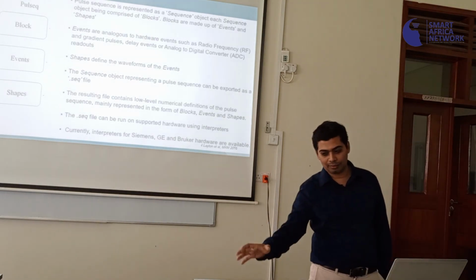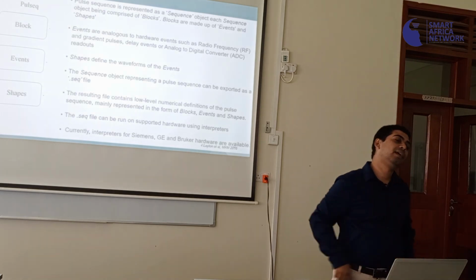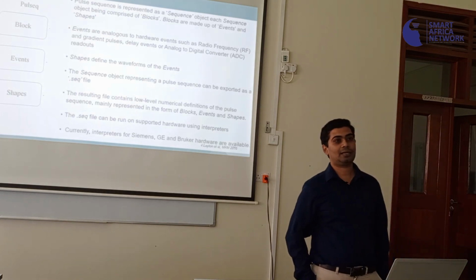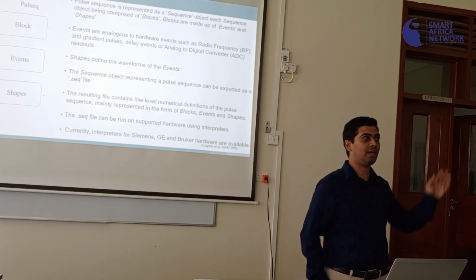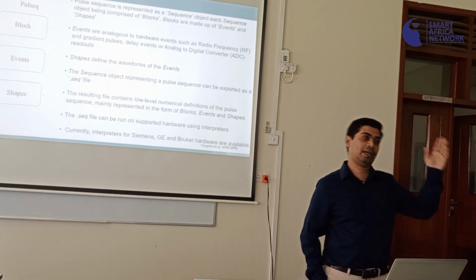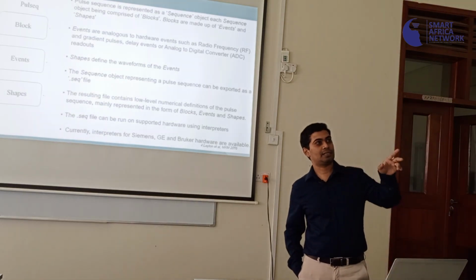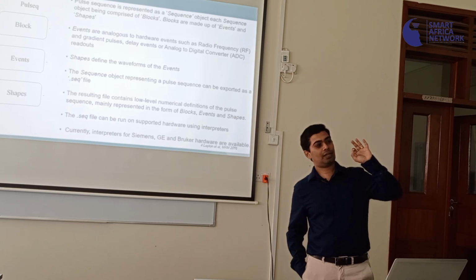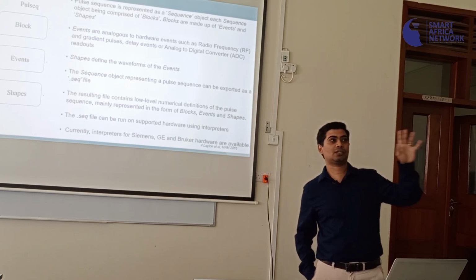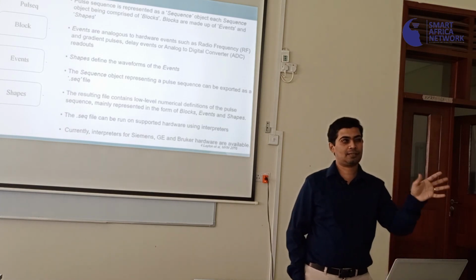So when we want to do it at a higher magnetic field, you build this kind of system, and then you say, I want to actually move it away from its alignment and then watch it go back. That's the whole process that we're looking at. For that, you need to send out a pulse, just like you send out a pulse from the radio station tower to the radios that you're receiving. It's pretty much very similar to that.